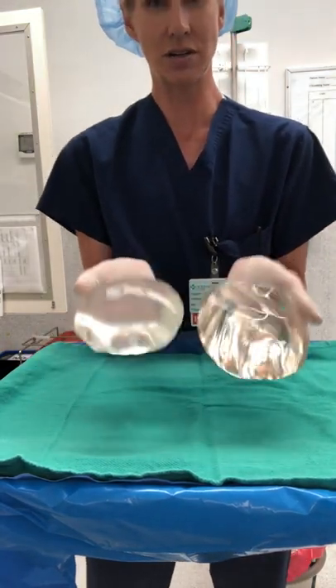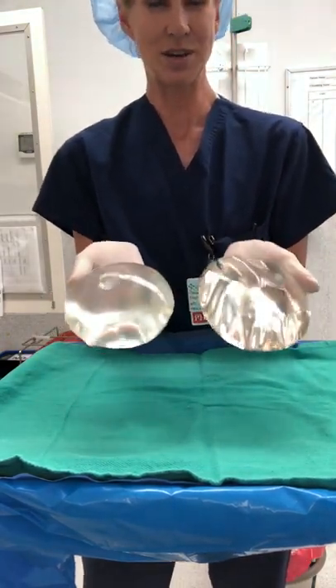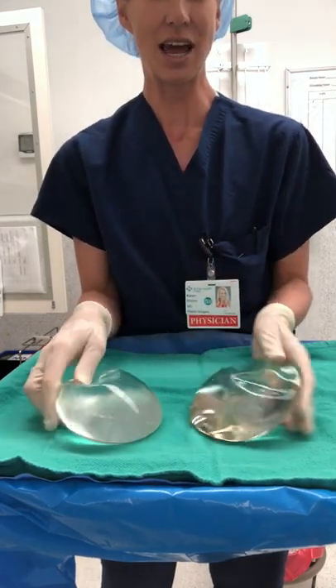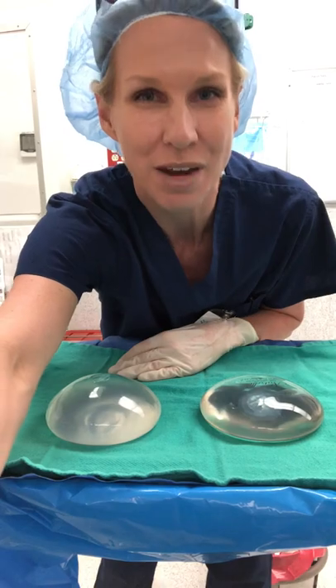Given the option, which one would you want? I think most women would want the silicone gel, just both for breast augmentation and for breast reconstruction. Hope that information helps.